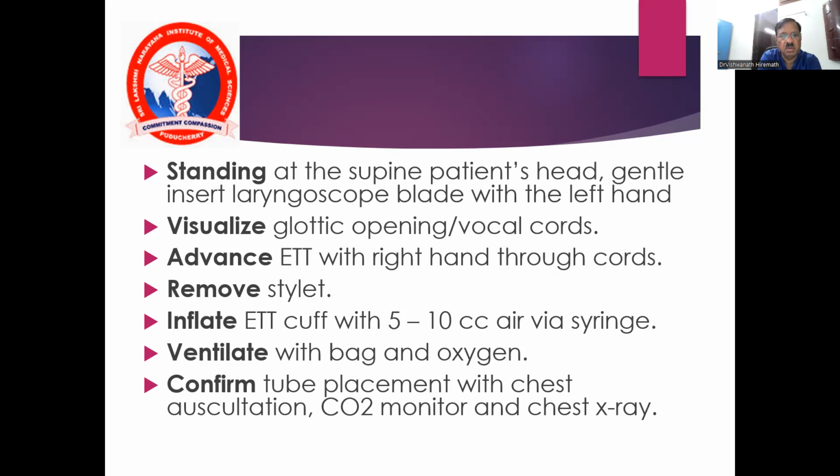But in general, the patient should be either unconscious or made unconscious by anesthetic supplementation, then only endotracheal intubation should be carried out.